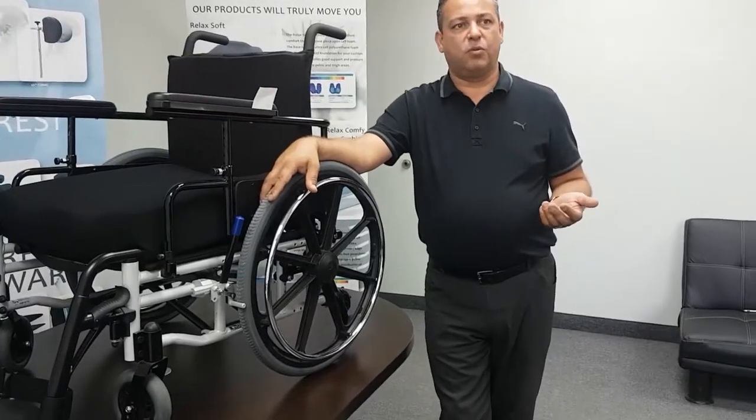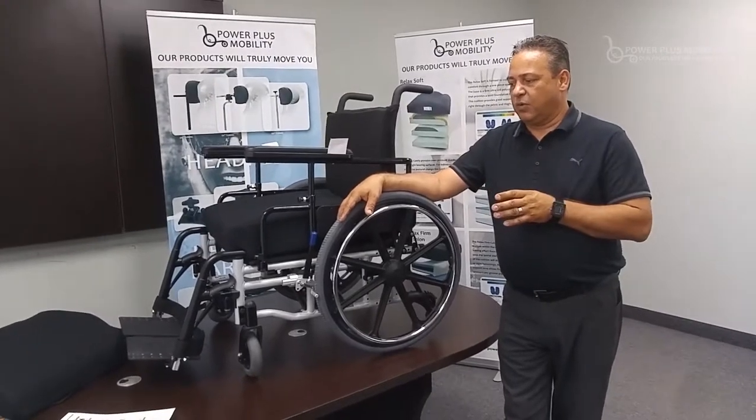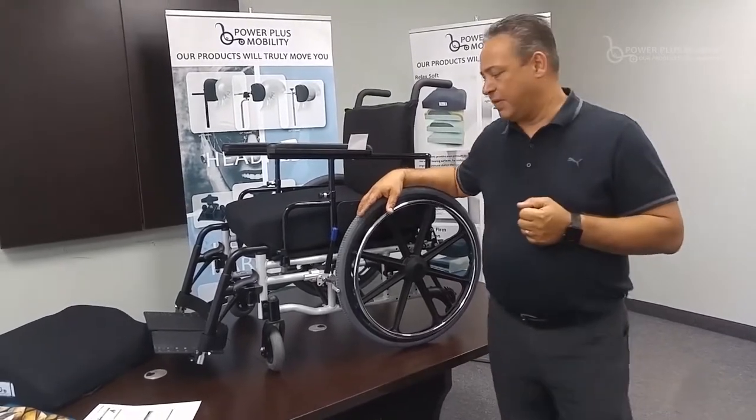Weight capacities of the chair will range anywhere from a standard of 250 pounds right up to 600 pound weight capacity. We tend to use this for higher weight capacities for those bariatric clients, but we also use it for 250 pound weight capacity.